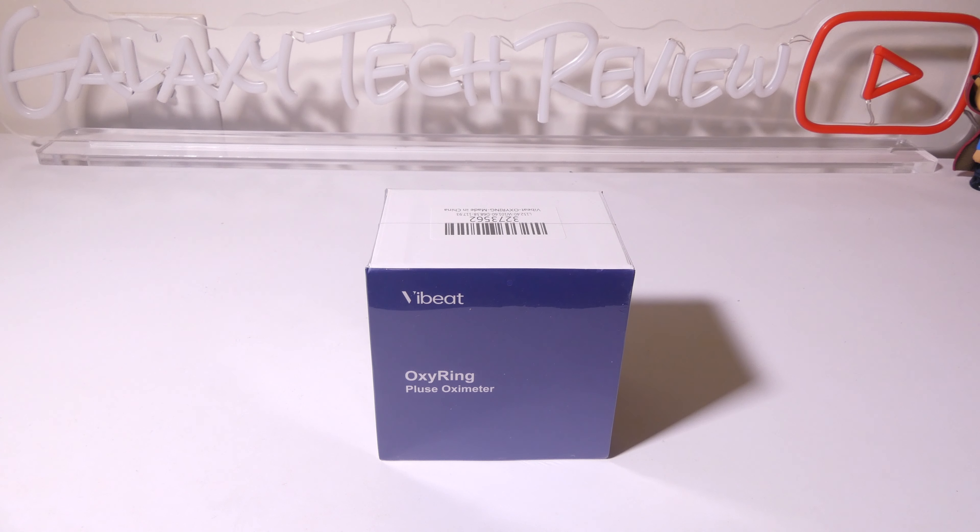Hey everybody, it's Luke over at Galaxy Tech Review and today I've got a product from Vibeat. This is the OxyRing Pulse Oximeter, and this is good if you want to wear this while you're sleeping for overnight readings, to see how your SpO2 or oxygen level does overnight or for longer periods of time.